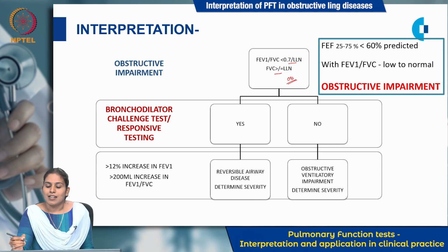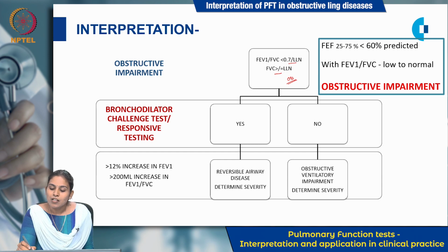So this is the new update. That is your good to know part. Okay. So with the FEV1 by FVC ratio low to normal.